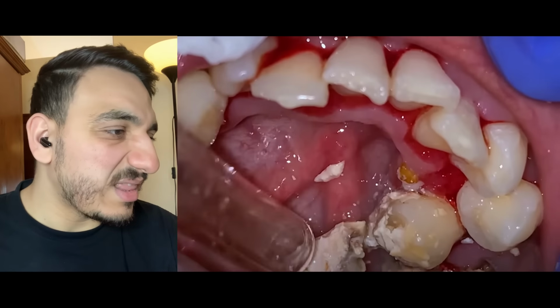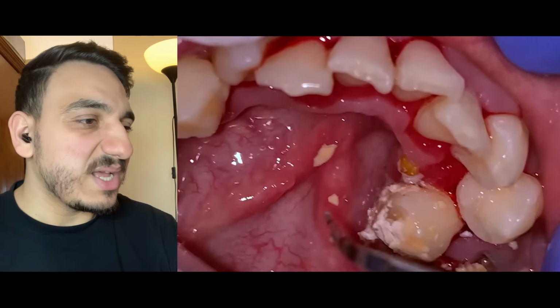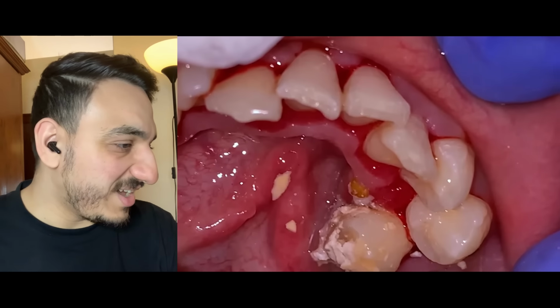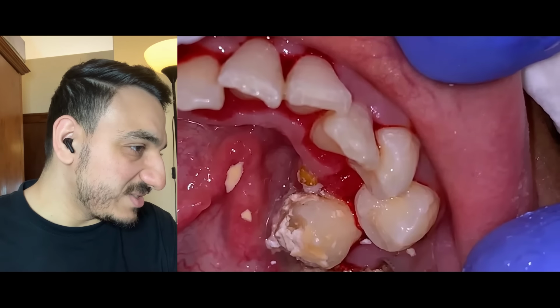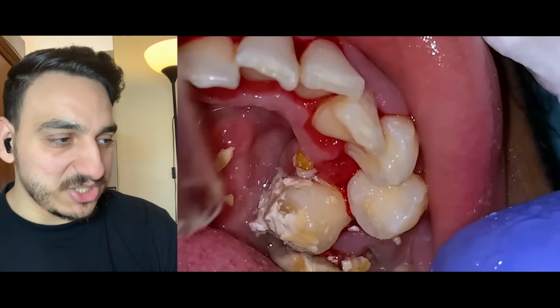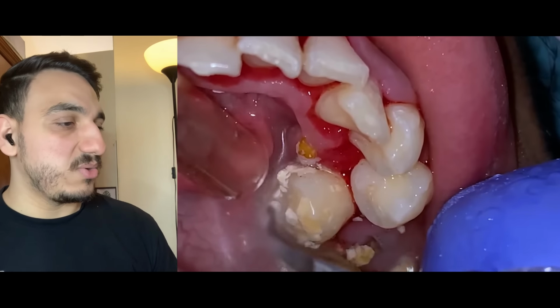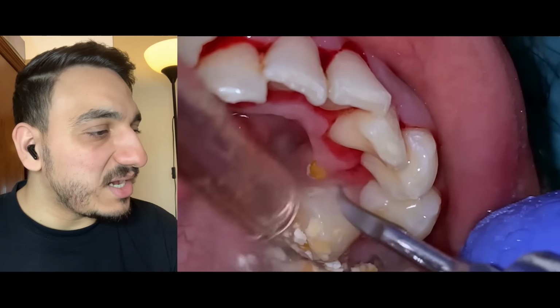Let's look at that huge piece of dental calculus removed by the assistant and falls off right there. And oh my God, what a mess. That was a pretty huge piece. Of course, this suction is extremely helpful. Sometimes there's just a piece that is too big to be taken into that suction tube, and that does happen.